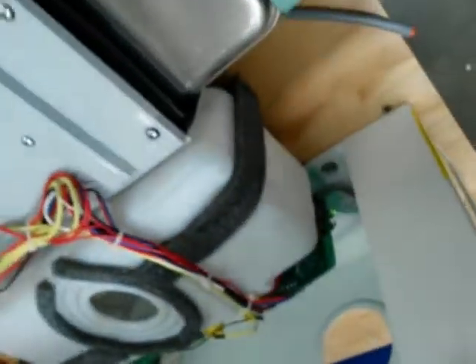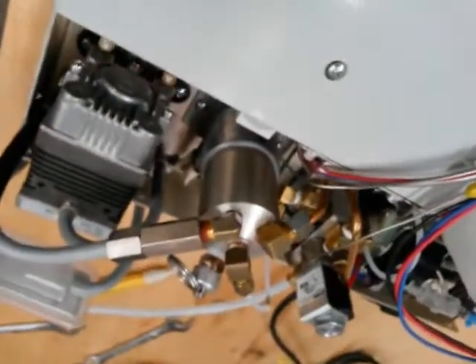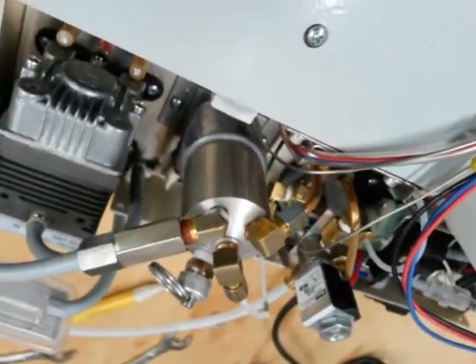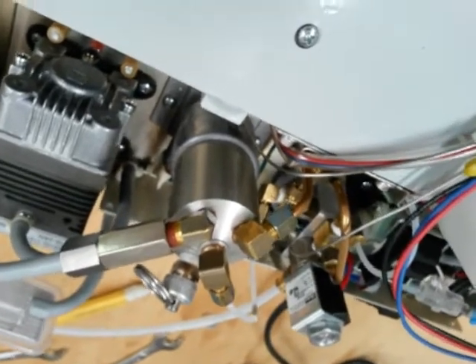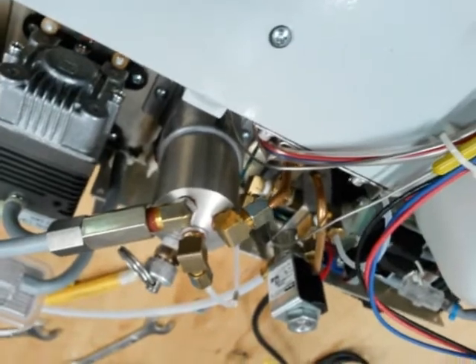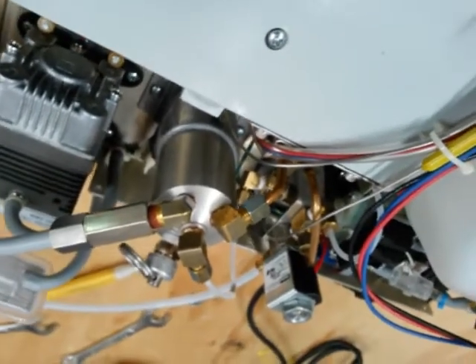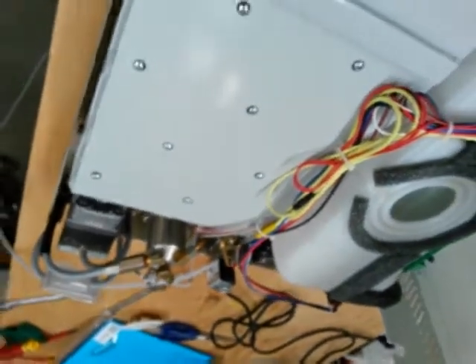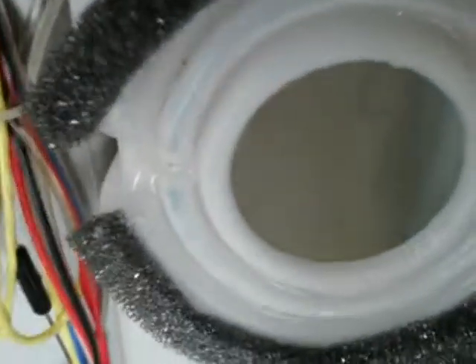So we switch it on, we've got power, and we can hear that solenoid clicking. There we go — that's all good.